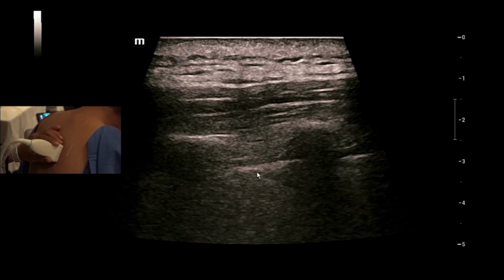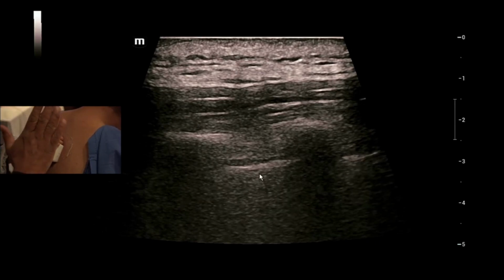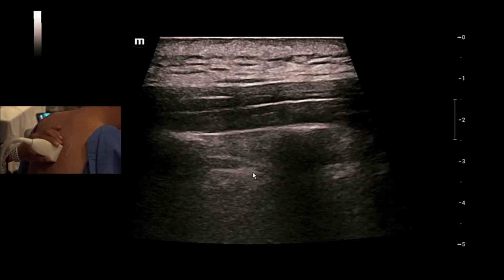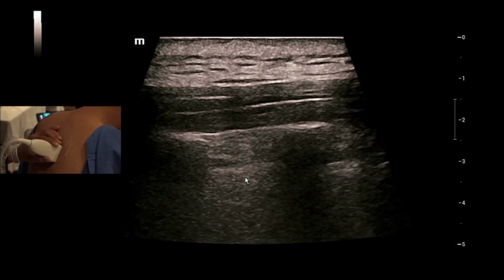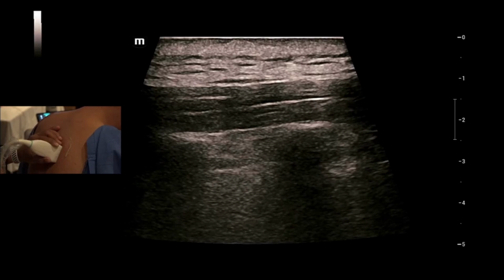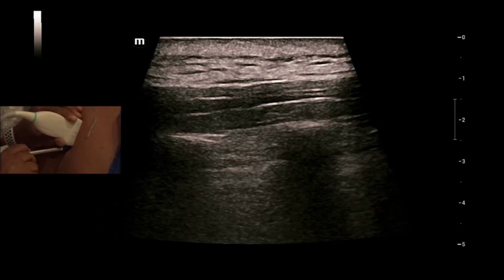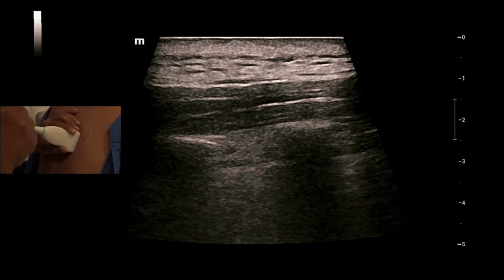So what this does is it brings the beam at right angle to the pleura. That's all it is. There's anisotropy. For those of you who understand, anisotropy is an artifact. But nevertheless, the next challenge that you have is, if you want to insert a needle in plane, like so, if I were to imagine that this is my needle, and I'm going to insert it in plane from here, it'll emerge from the caudal end of the probe, right? The angle of insertion is very steep.